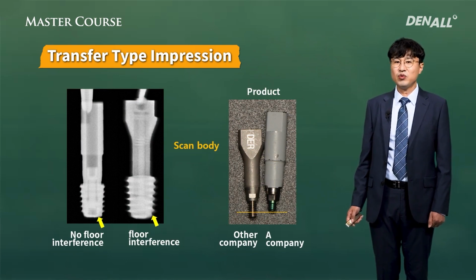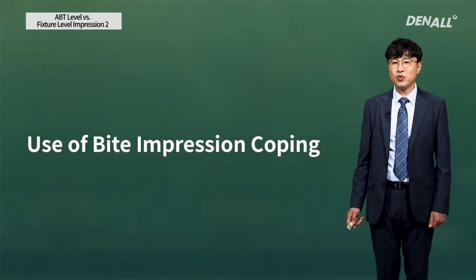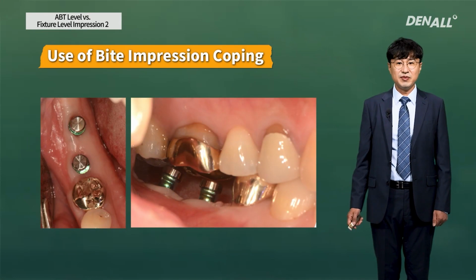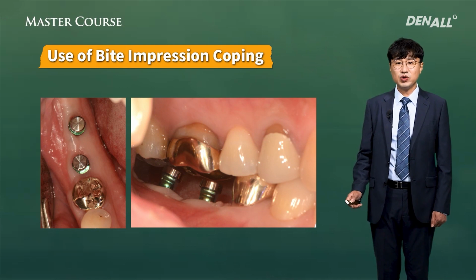Next is usage of the bite impression coping. And here, the bite impression coping, you connected the hex correctly in the mouth, and again, the important area is this.